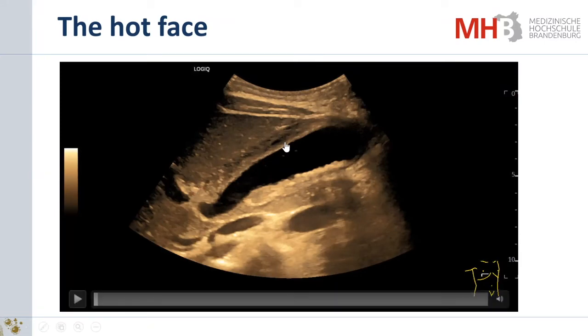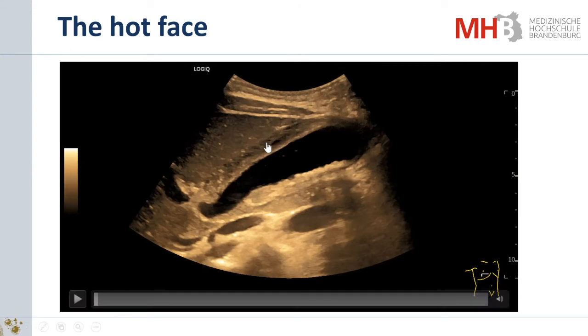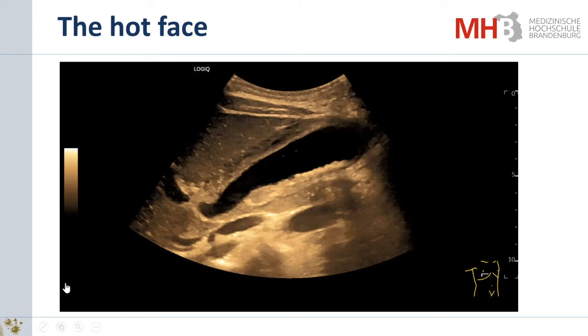And what's this? I have shown you the normal phase of gallbladder. That means this thin hyperechoic wall, and another example of a patient after breakfast with a little bit thicker wall with 3 layers, but here is a thick wall and no layer.